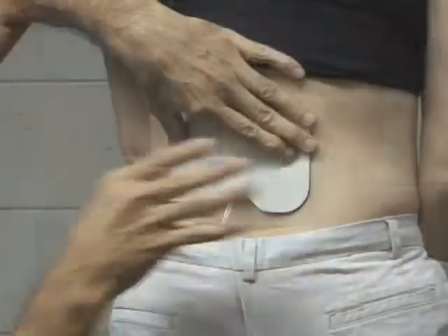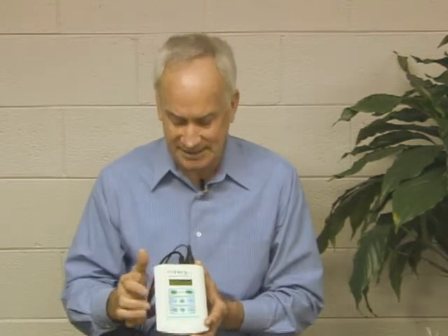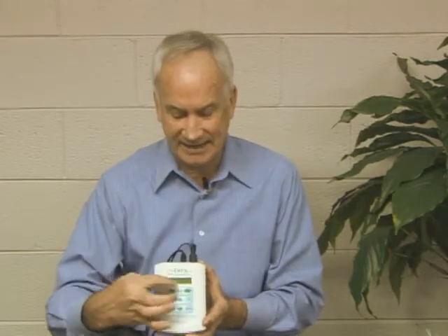Let's say you're getting ready to leave the house to go to work and you've got a nagging pain — then you flip over to the TENS side of the unit. Here's the difference: you can wear TENS 24/7. So anytime you're hurting, or getting ready to do something you know is going to be painful, put on your TENS unit. And that is already built inside the NFREX Plus unit.